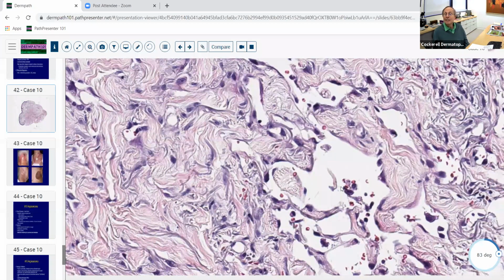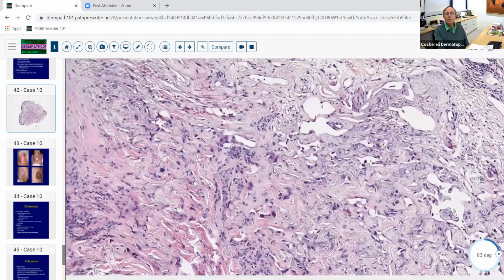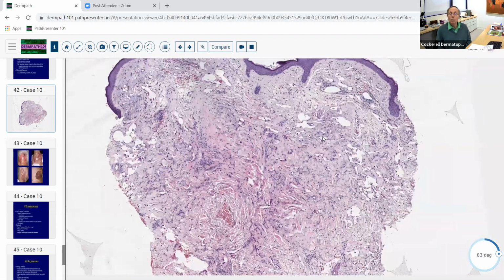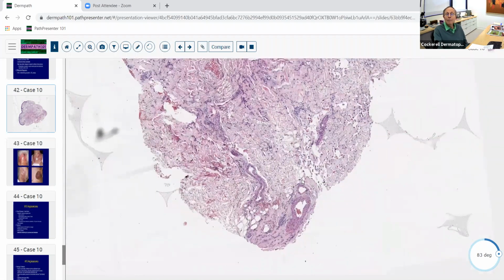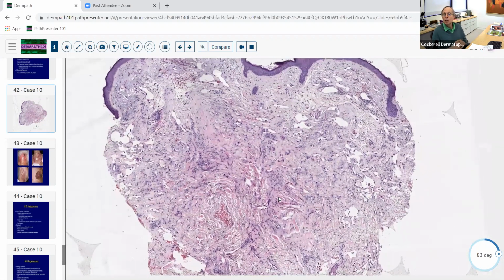If you get a malignant neoplastic vascular process, you may not have a lot of red cells. And here you've got all this very diffuse process. So we see neoplasm, we'll take it by punch technique. Once again, we can't assess breadth, symmetry, circumscription, those sort of things, but we can notice that it's diffuse. It goes from side to side and pretty much from top to bottom here. So that isn't a good sign. That means we punched into a sea of neoplastic areas. So that's a sign of very poor circumscription and breadth in all likelihood.